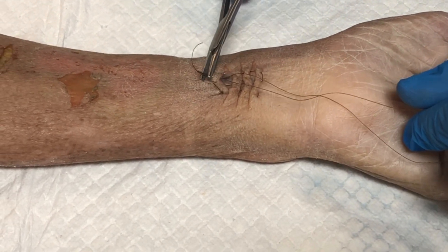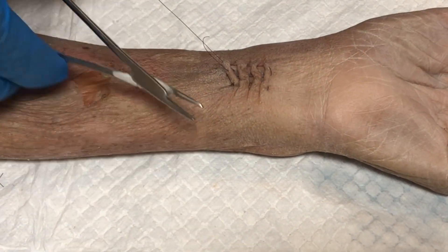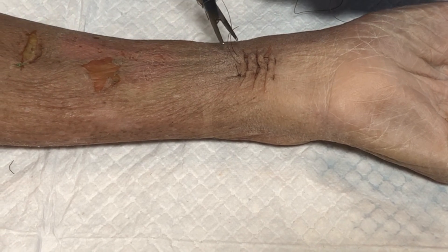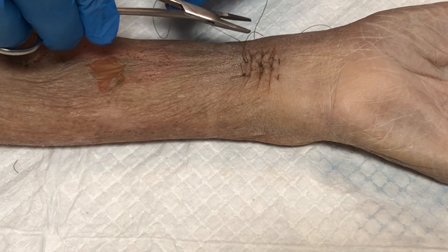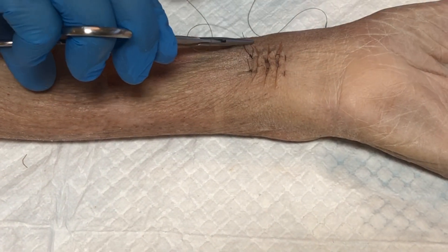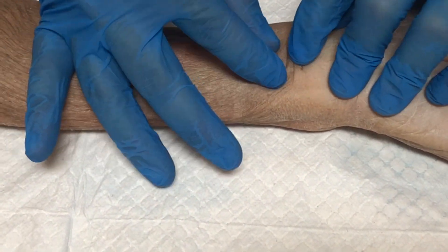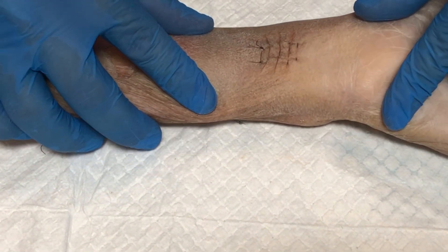Pull the needle through with the needle driver, then tie this off with your standard surgeon's knot, going in the opposite direction each time. Cut your thread, and as you can see this has been brought together very nicely with two sutures.